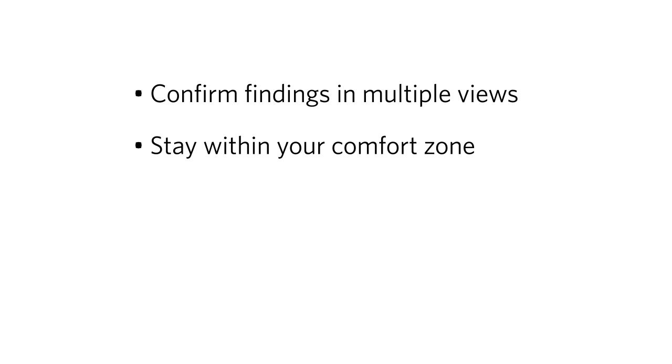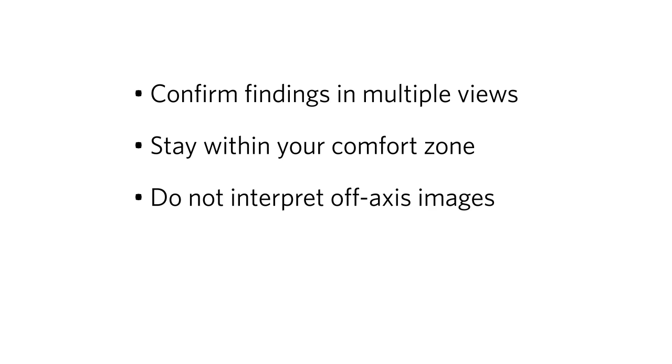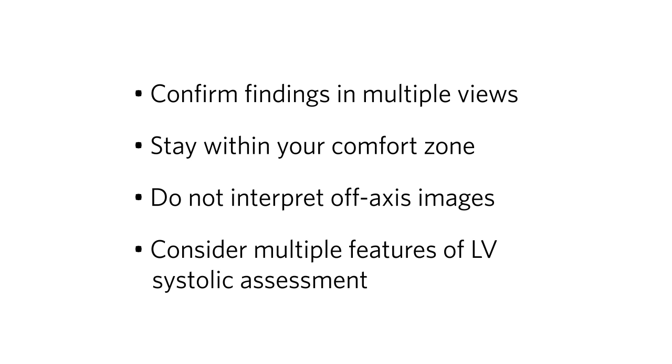Always confirm findings in more than one view. This will decrease the chances of misinterpretation. Stay within your comfort zone. Spend your time acquiring skills in one view before moving on to other views. Don't interpret off-axis images, as this will lead to misinterpretation. When assessing LV systolic function, consider multiple features of LV systolic assessment and check at least two views.